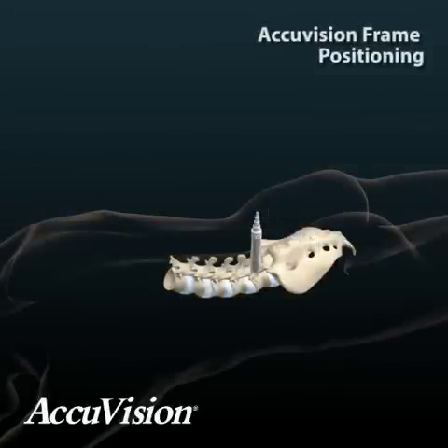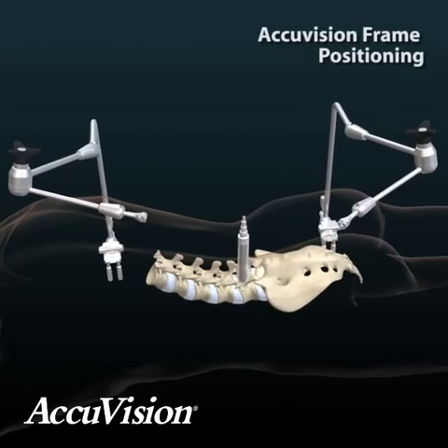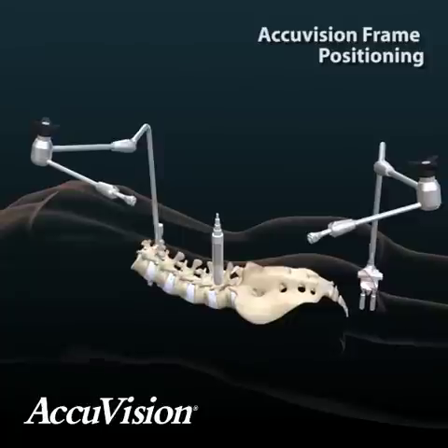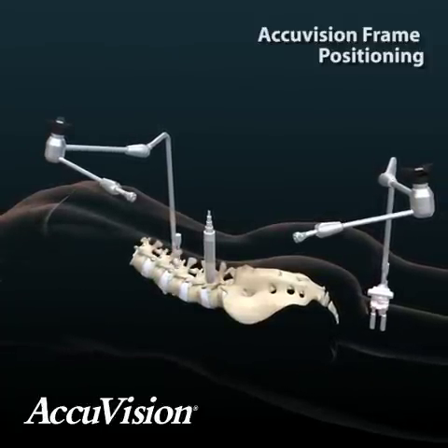In preparation for the surgical procedure, the field posts and access arms must be set up on the OR table. These articulating arms will provide stability and rigidity to the Accuvision frame while allowing for intraoperative repositioning.